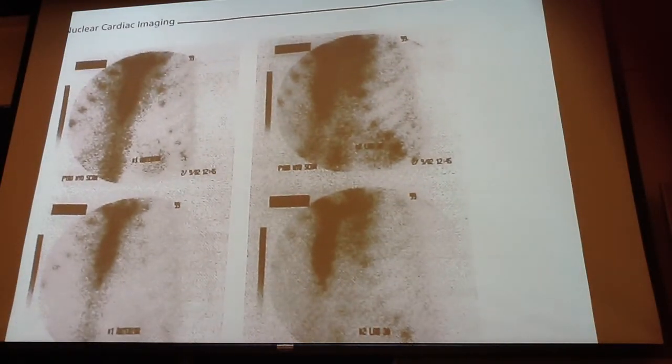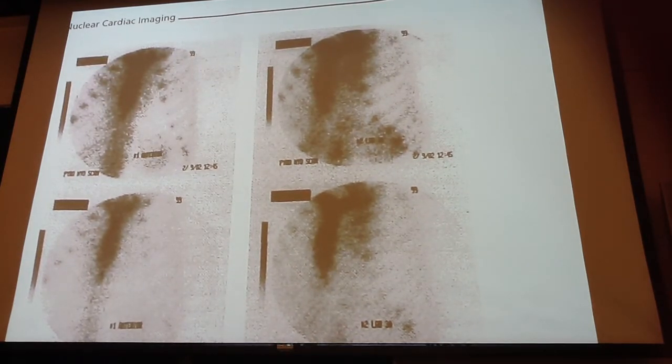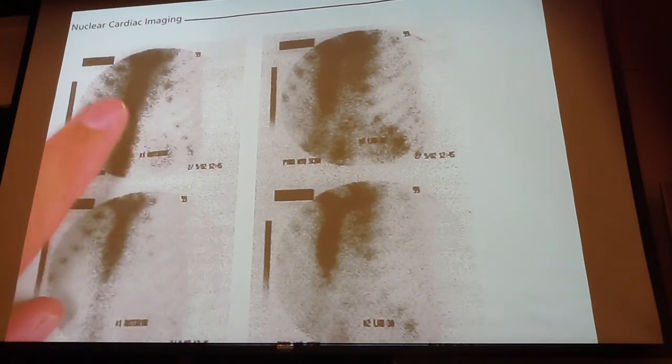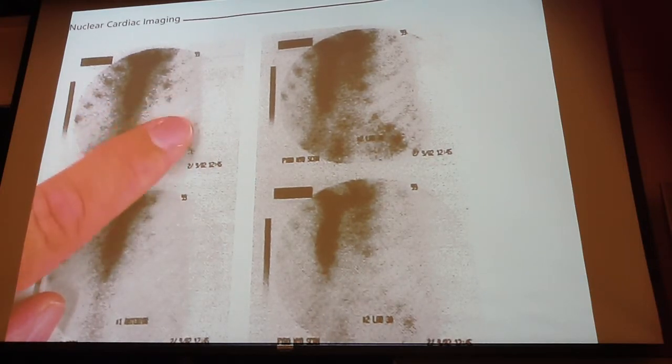Some of the other things I would like you to be aware of: these are the positive infarct imaging agents. Normally, if I add the technetium to the pyrophosphate, so it's no longer just a cold kit, I inject it into the patient. Pyrophosphate originally was a bone scanning agent, which is what it was first designed for. In this case we see the sternum and the ribs, but we don't see any activity where the heart is. So this would be a normal study.